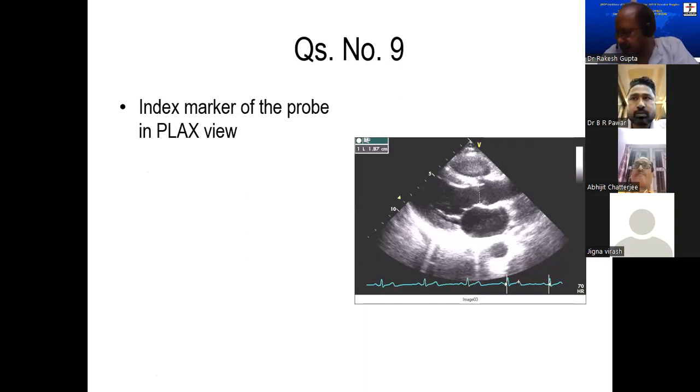2 centimeter. No, sir. You will land up in Delhi, man. No, no. We are measuring at aortic root only. LVOT diameter. Okay. In plex view, parasternal plex view. What is this view? This is a parasternal long axis view.